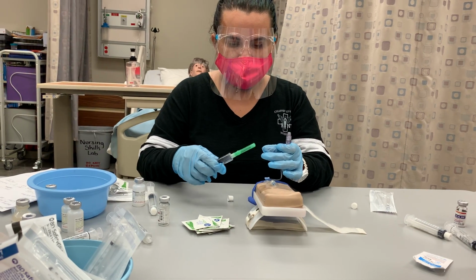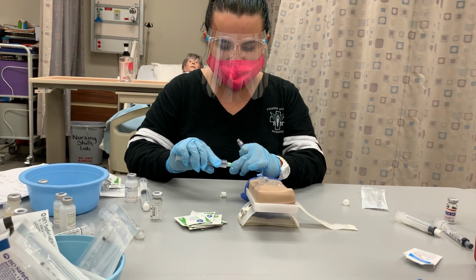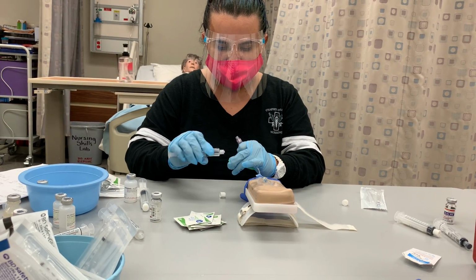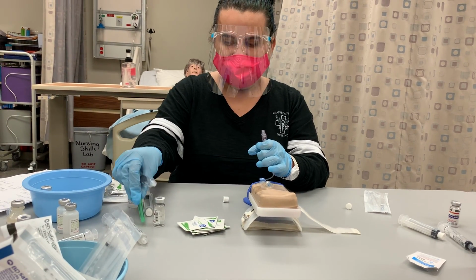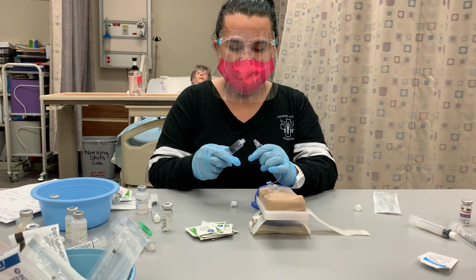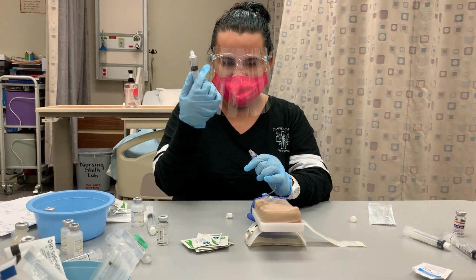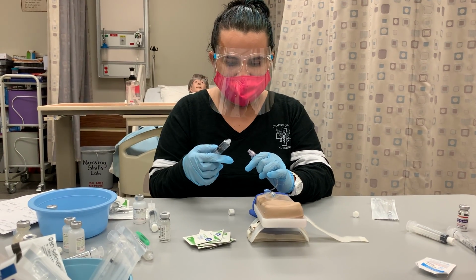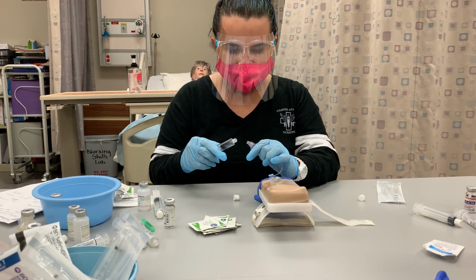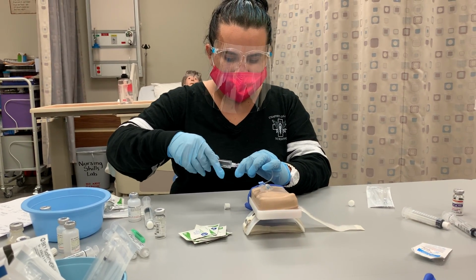With this, I can remove it, discard of it appropriately in the sharps container, and this would have 6 mLs. Because of the discussion, I wasn't able to put it out, but it would have 6 mLs. And I would attach my medication.